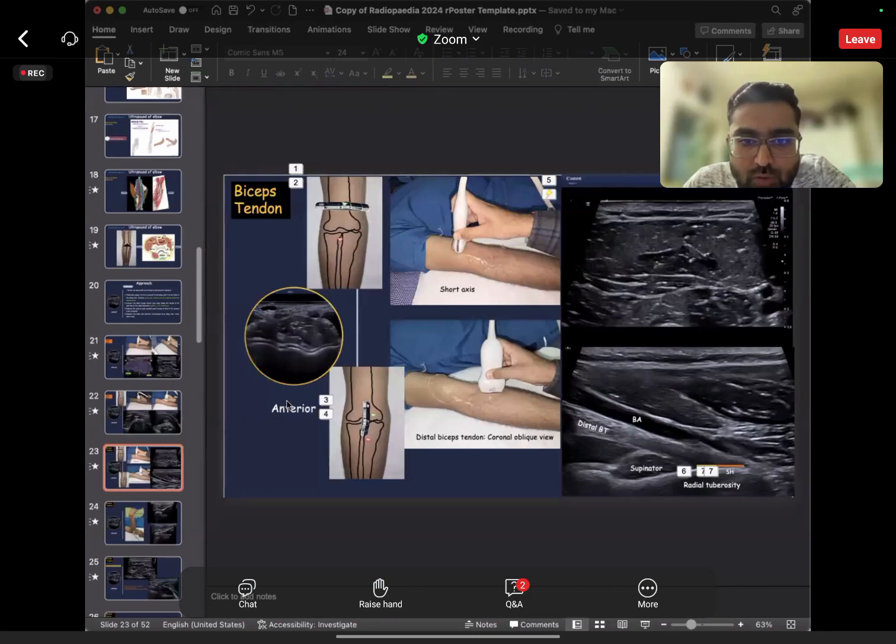Please show the position of the elbow for the medial and lateral compartment. Okay, so I'll answer these two questions. Okay, so my screen is visible, right?